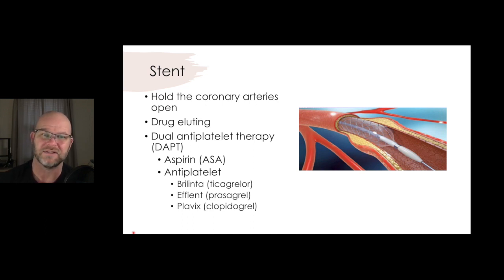So what kind of medicine's on the stent? Well, I always thought before I got in the cath lab, hey, this will be some type of something to prevent clot, something to stabilize the cholesterol in the plaque. It's actually a cancer drug, and that prevents that body from overgrowing too quickly. As those epithelial cells grow in sheets, this prevents that from growing the whole thing, filling it up with scar and causing that to close back off. So the drug-eluting stents are pretty much the standard as well.